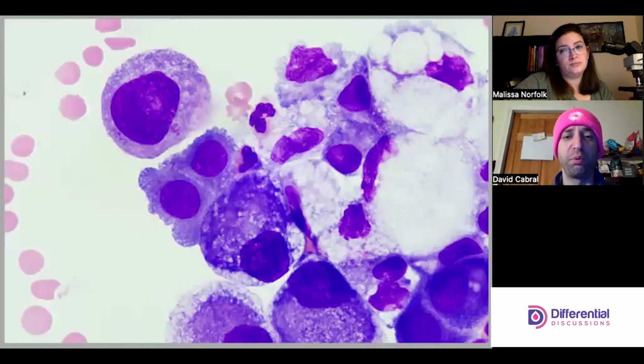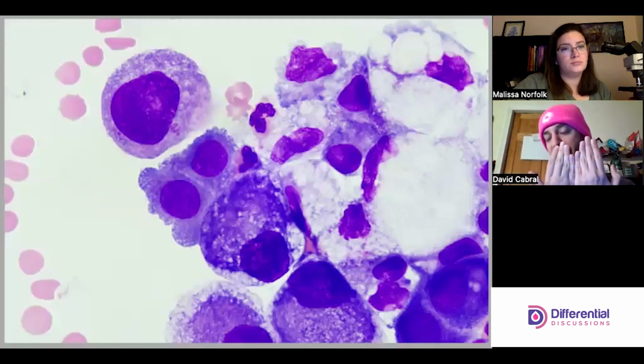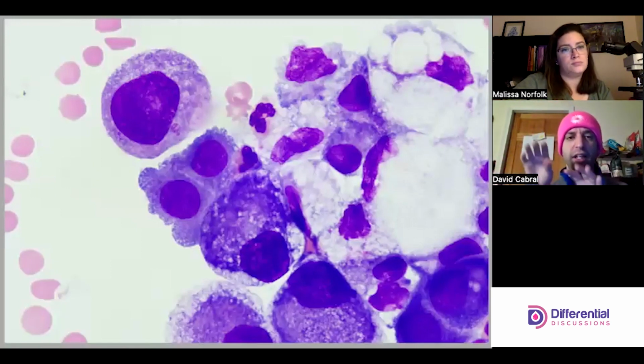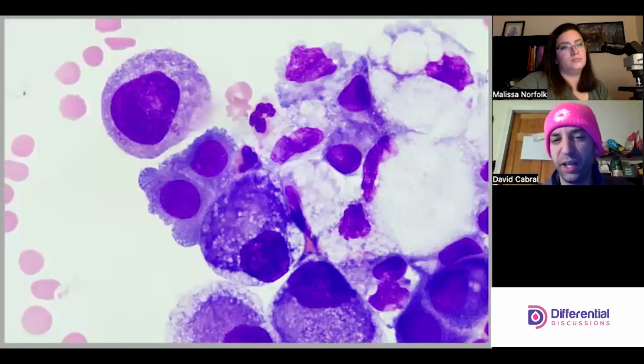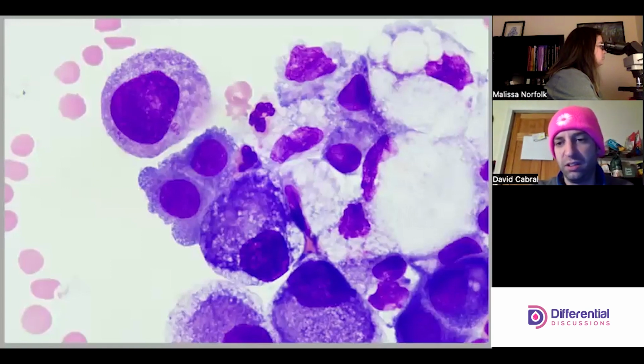The blebs are a good point to bring up. In my mind's eye, my intuition is if I glue two pieces of paper together and then separate them, they're not going to tear perfectly along where they were adhered. So you get that kind of frayed edge. It's very common with mesothelial cells to see that.